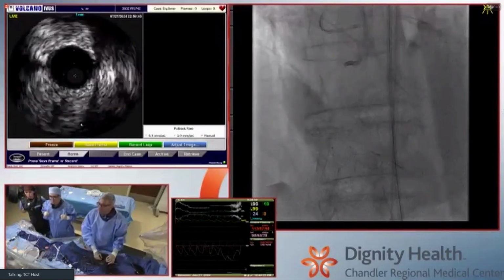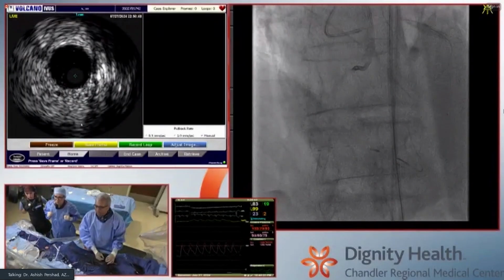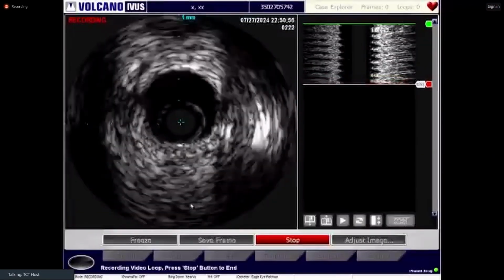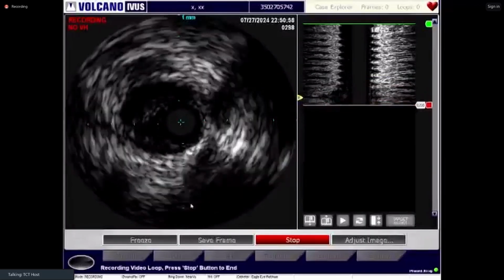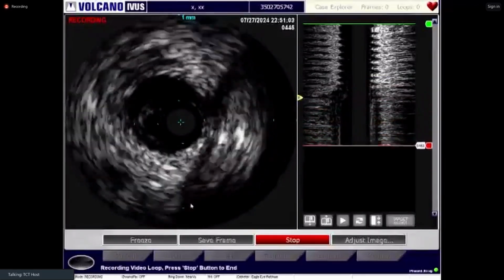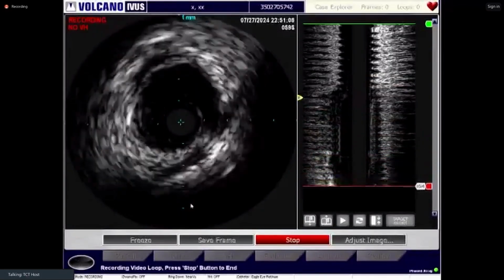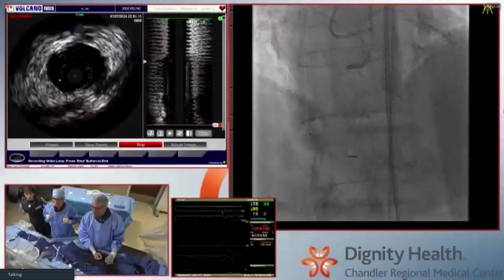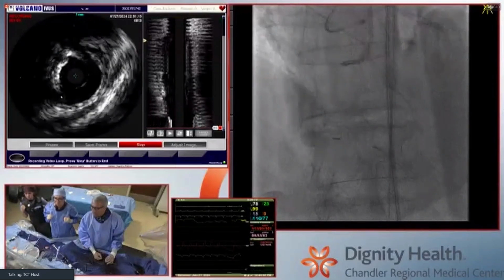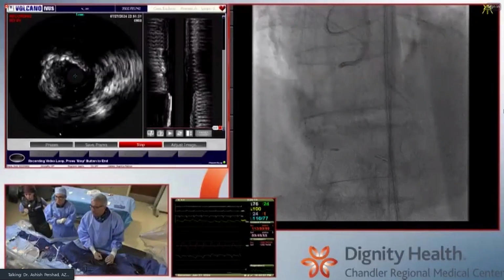Okay, let's start pulling back. Go ahead. Recording. Assuming this is true lumen, even though I don't see any intima yet. So that's, to me, that's the tissue. That's 9 o'clock. What is that? To be honest, it's very difficult to interpret. Okay, that's a true lumen at 9 o'clock, and we are very sure it's subintima, which is where we did all the knuckling. That's perfectly fine.